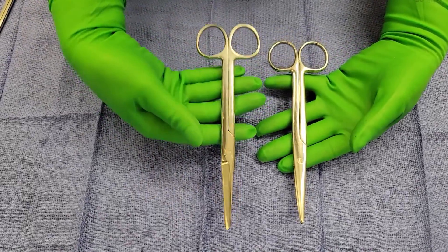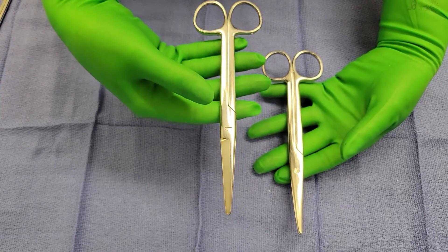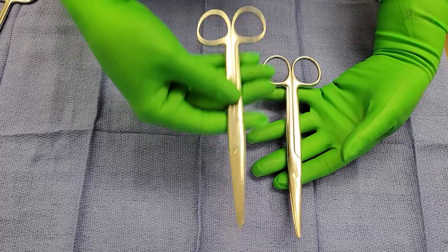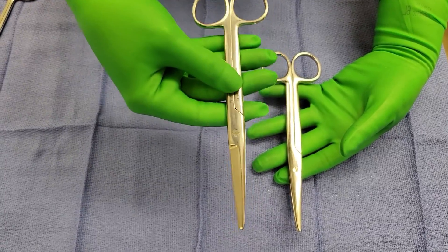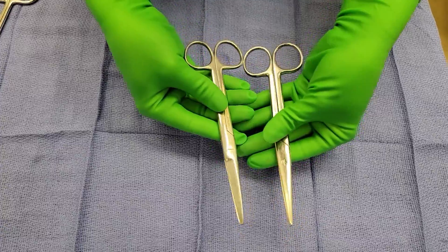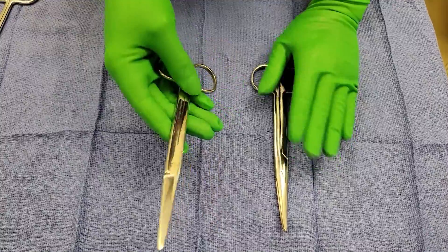Another thing to point out is that the straight Mayo is commonly referred to as a suture scissor. So if you hear somebody on the field say 'suture scissor,' you would want to give them the straight Mayo as opposed to the curved Mayo.